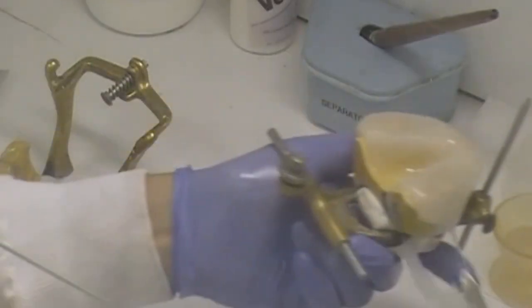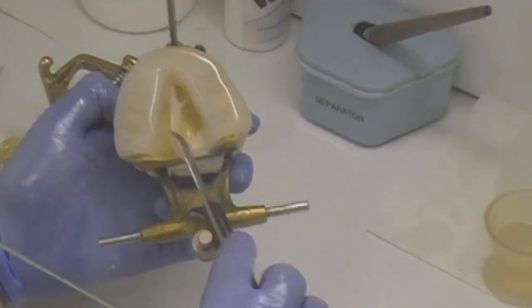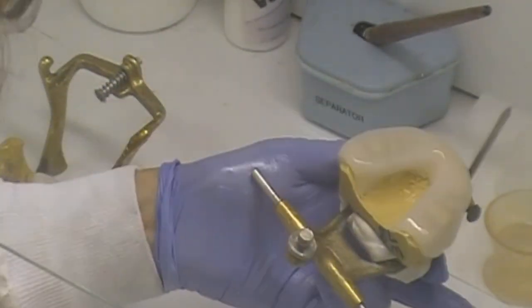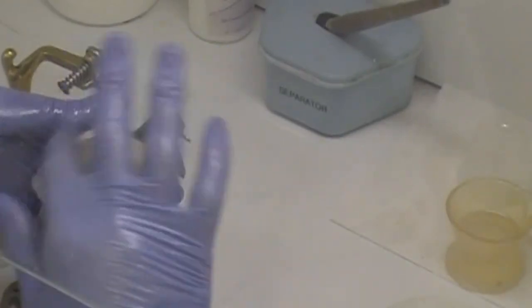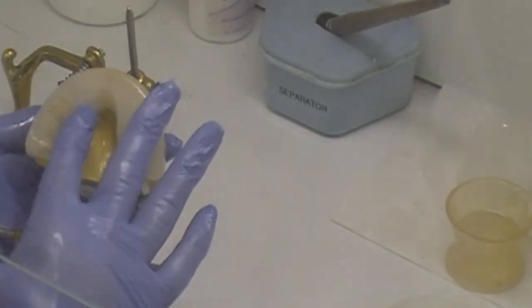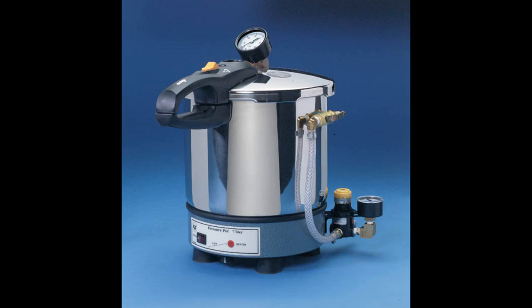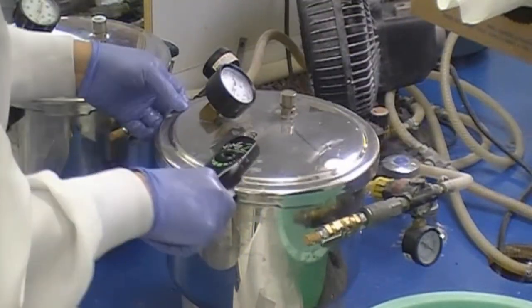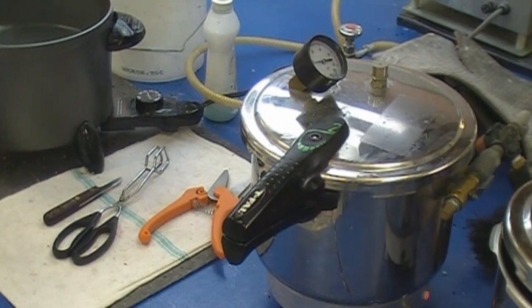Excess material may be cut off if desired before placing into the pressure pot to cure. If an occlusal registration is needed, assemble the articulator and close to bite position. A heated Great Lakes pressure pot is used. The model or models with formed resin is submerged in water within the pressure pot. Water temperature is about 125 to 130 degrees Fahrenheit. The preset pressure used is 20 PSI. Cure time is one hour.